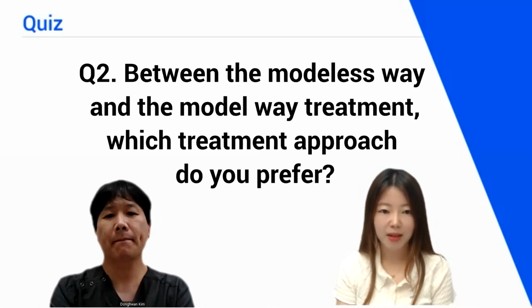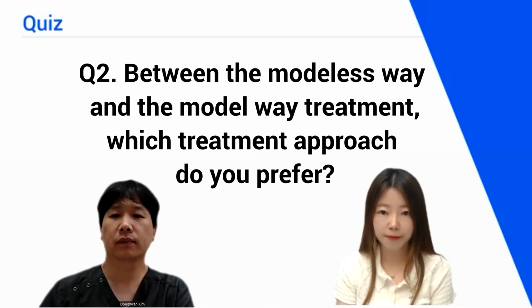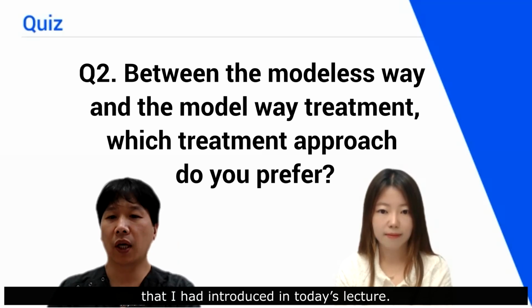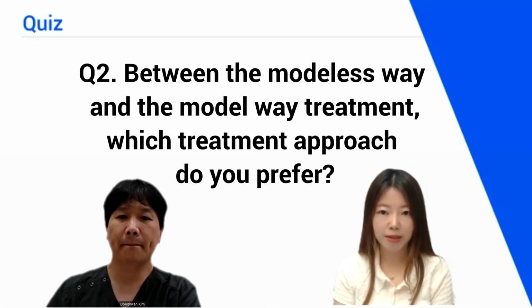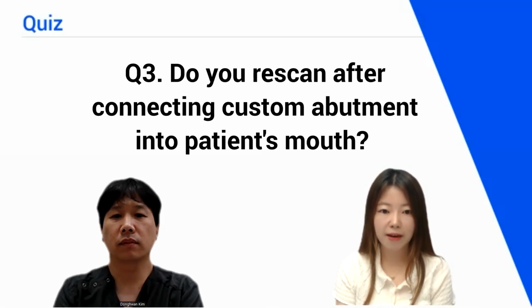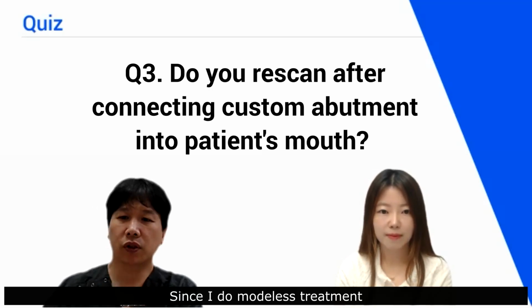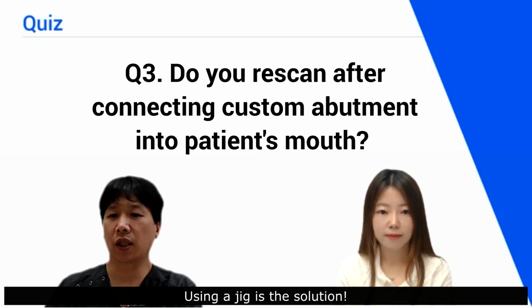Question number 2. Between the modelless way and the model way treatment, which treatment approach do you prefer? I prefer model treatment with the method that I had introduced in today's lecture. Okay, question number 3. Do you rescan after connecting custom abutment into patient's mouth? I had the same answer just as the second question. Since I do model treatment, I can overcome the fitness error prior to a patient visit. Using a jig is the solution.